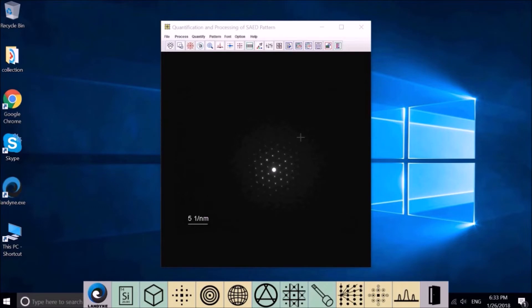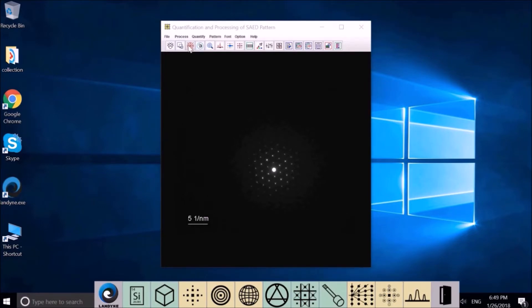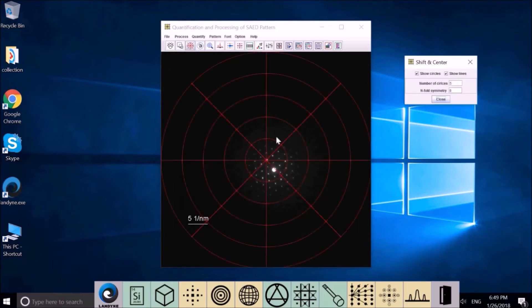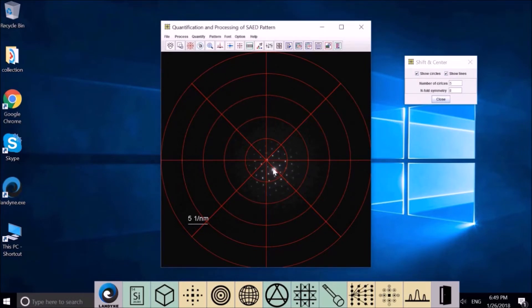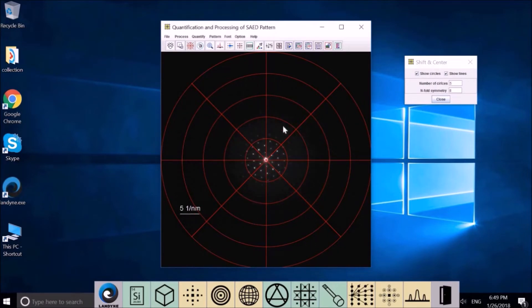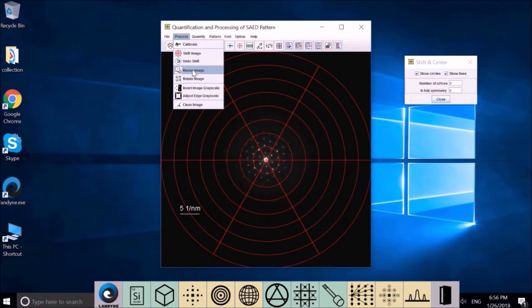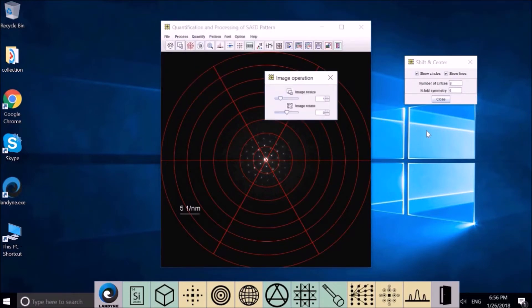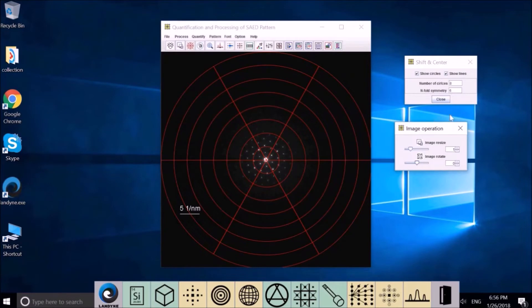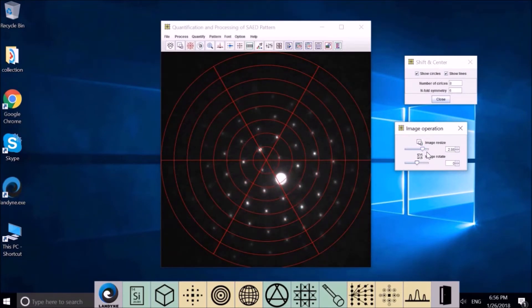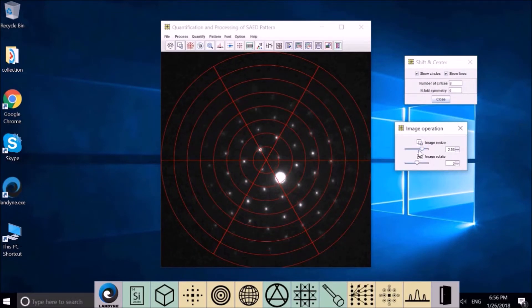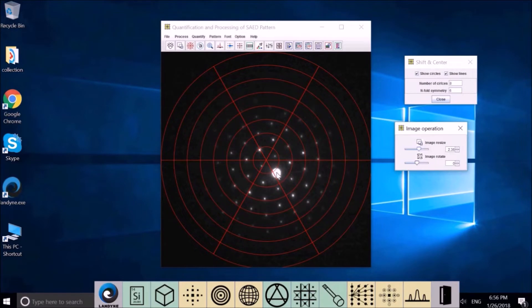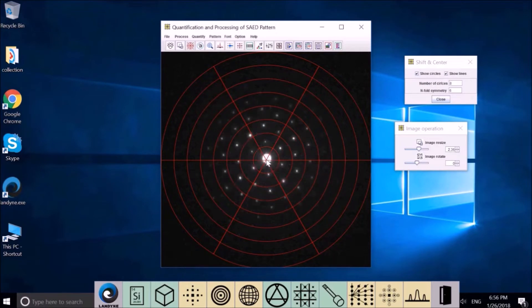QSAD3 simplifies the process. First, click this button. Choose this point and hold mouse left button. Move mouse point here and release. The guideline can be changed to resize and rotate. Just drag this slider bar to move your pattern center back to here.